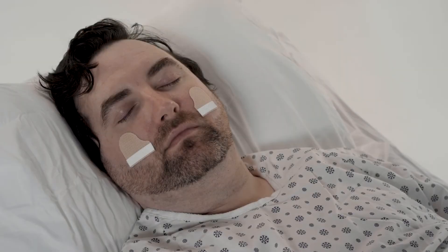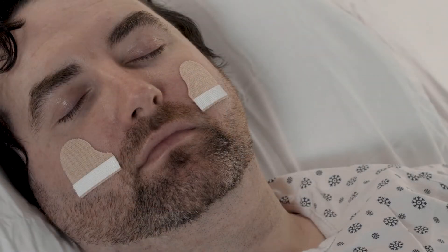The base may be modified for patients with facial hair by cutting off the tabs and placing them on the cheeks, past the hairline.